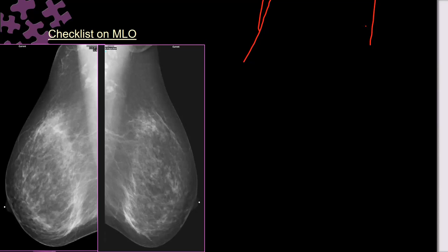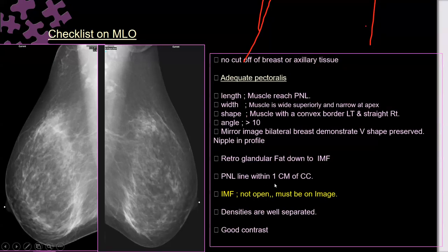And this one. Who said the nice one before? The first case, that case. Who said it? Is that the inframammary fold smash? Slightly. Yes, that is also mine. This is my patient. Yes, agree with you, the inframammary fold is not open. It must be open on the image. Yes, agree.